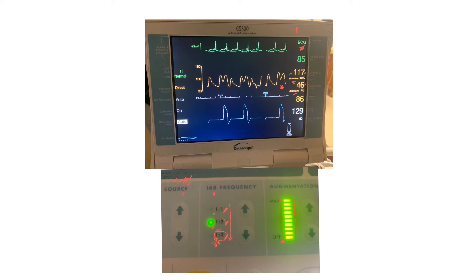The inflation and deflation timing of the balloon can be set manually or automatically, as shown here. This indicates the pressure needed to fill the balloon with air, and this shows the helium amount in the balloon. You don't need to know all these details, but it's good to have a general idea — we leave all of this for the cardiologist to handle.